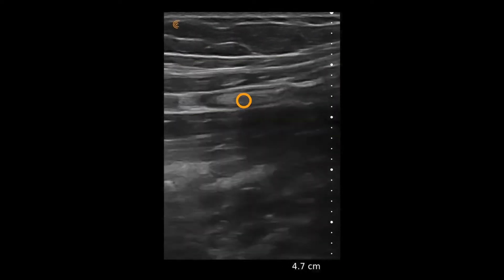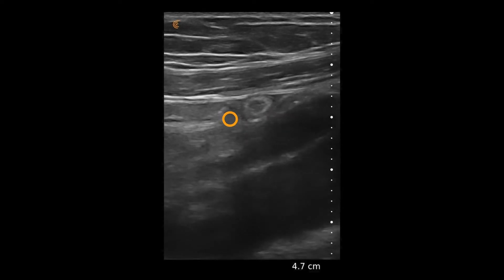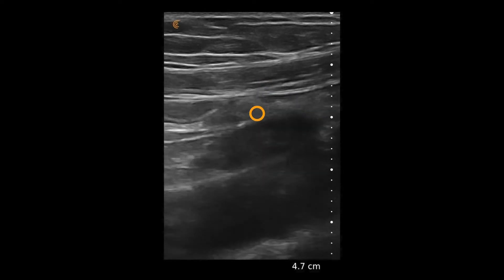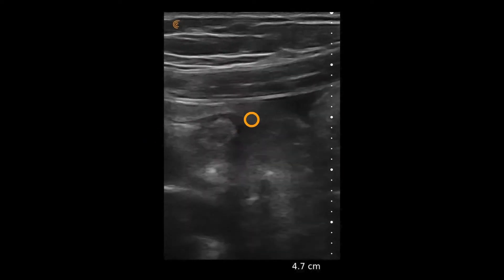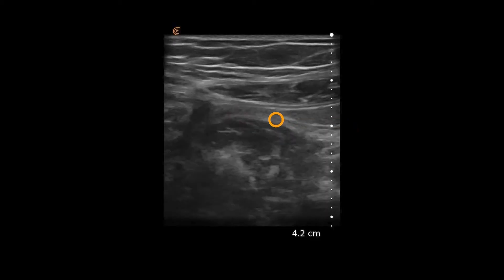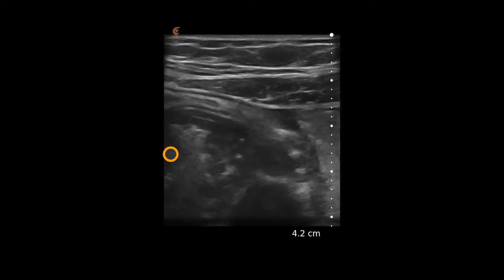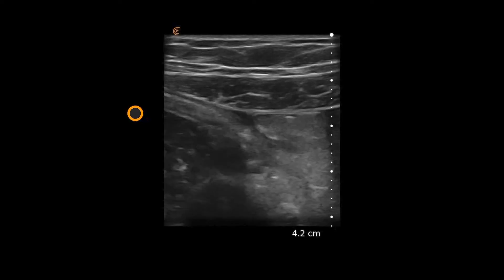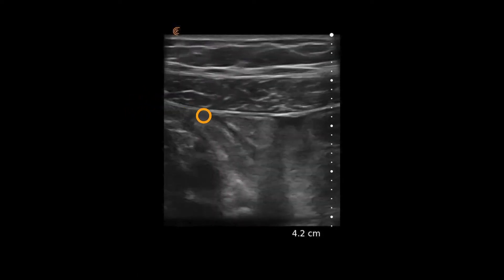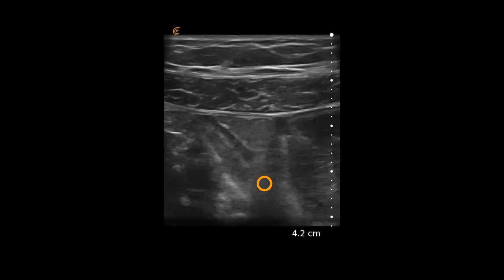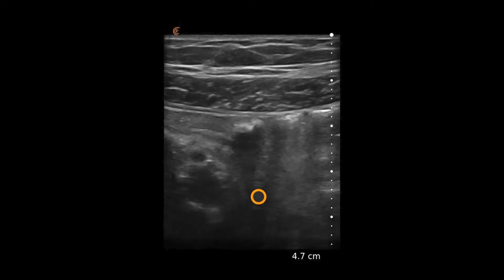The object can be scanned to see roughly its diameter and where it's going from its entry to its exit point. In the setting of a suspected appendicitis, the transducer is rotated to see the entire length of it coming down to a blind-ended pouch.